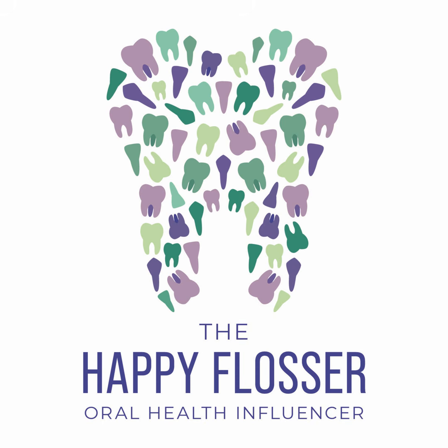So what are some of the general guidelines and patient management process in regards to radiographs? The first thing is radiographs can be really hard for some patients, so you want to always appear confident. Even if you're not confident, you want to help relax your patient because a relaxed patient is an easier patient to take radiographs on.